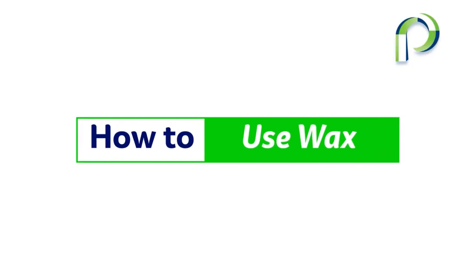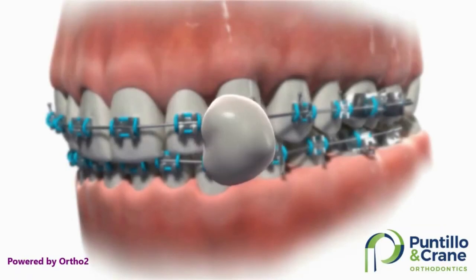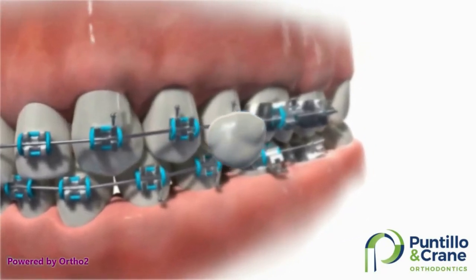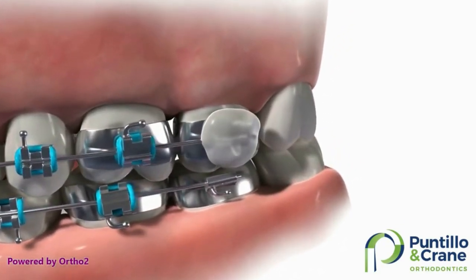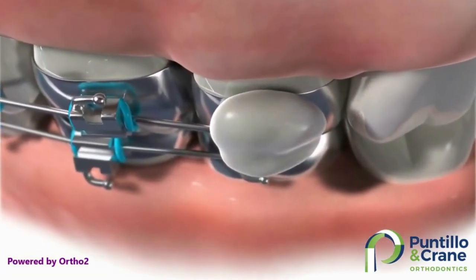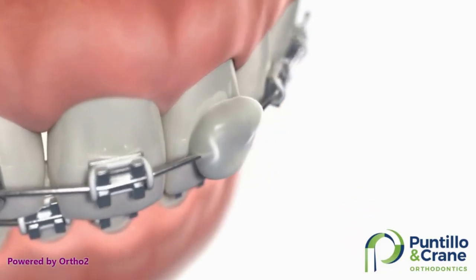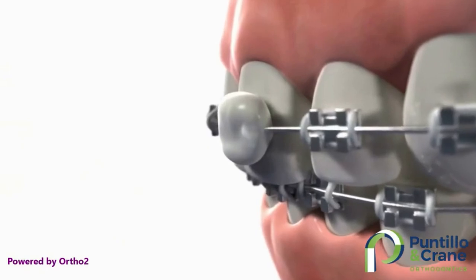Let's talk about wax. As you're getting used to your braces, you might feel some sore spots on the insides of your cheeks and lips. If you do, you can use orthodontic wax to cover the area that's bothering you. Just pinch off a small piece of wax, soften it by rolling it between your fingers, then place it over the spot that's bothering you. Drying the area before placing the wax will help it stick better. Remove it before eating or brushing.